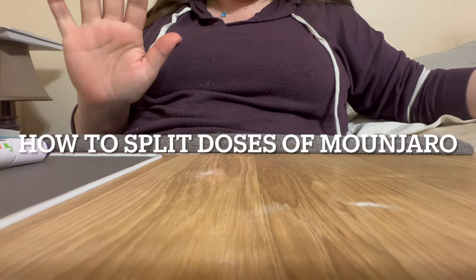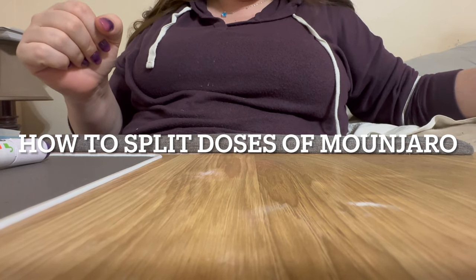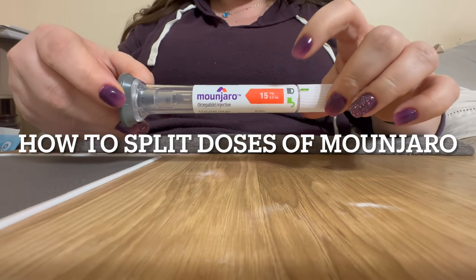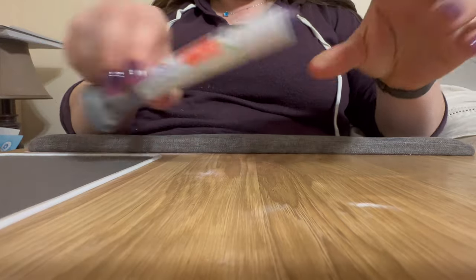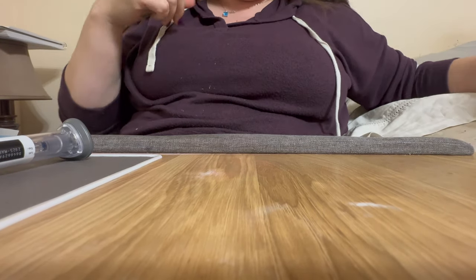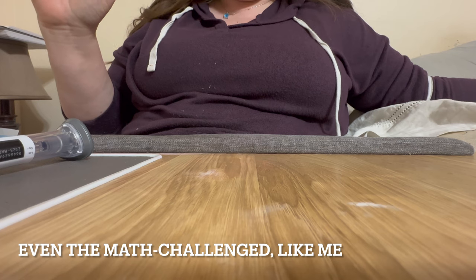I get a lot of questions about this, so I'm going to go through exactly how I split my own doses of Mounjaro from this 15 milligram pen down to whatever dose you need. It's really easy to do and it's much more cost effective. The supplies to do it are inexpensive and anyone can do it.